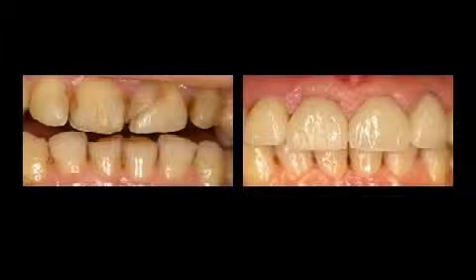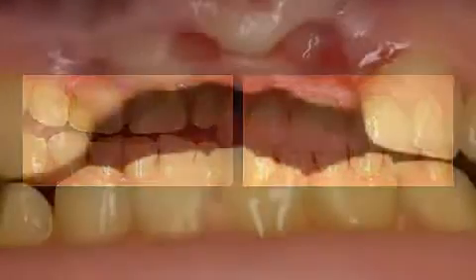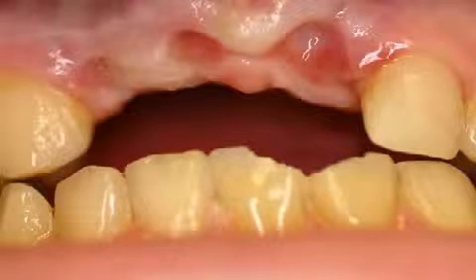This patient had a myriad of plastic fillings that kept discoloring due to her tobacco and coffee consumption. Veneers solved the unsatisfactory situation in her upper and lower jaw. You now see the veneers on the patient who suffered an accident. The lower incisors have been chipped away.